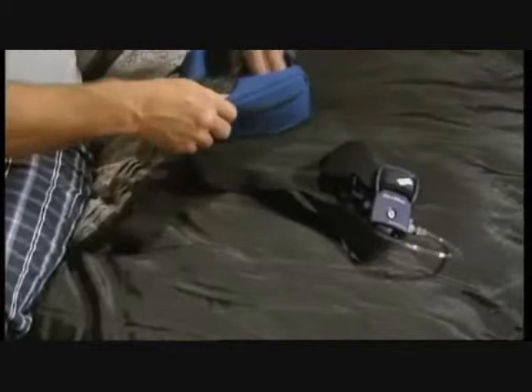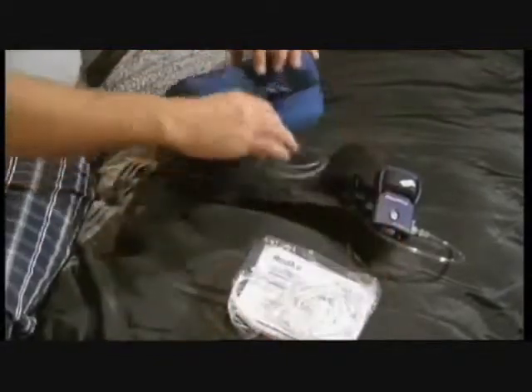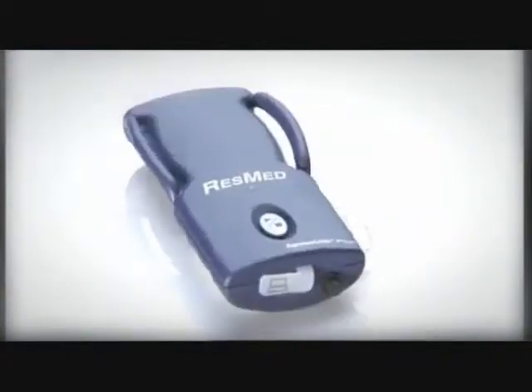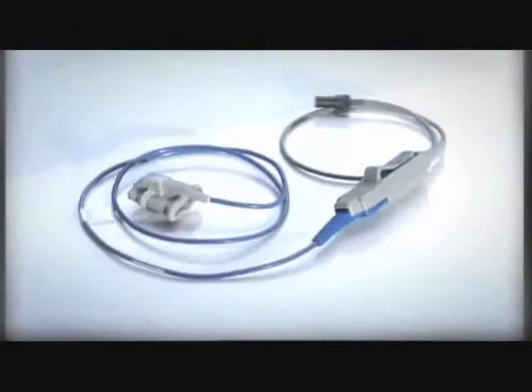Don't worry, it's simple and doesn't hurt at all. When you open the pack, you'll find several components. Some are disposable, like the nasal cannula. Other parts are reusable, including the belt, ApneaLink Plus recorder, and pulse oximeter.